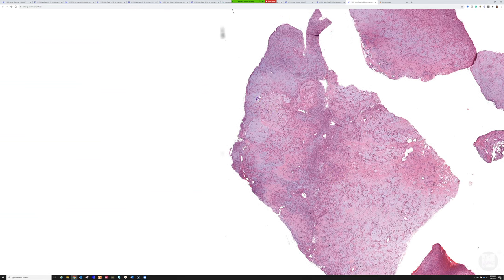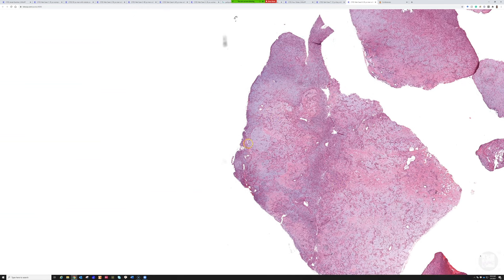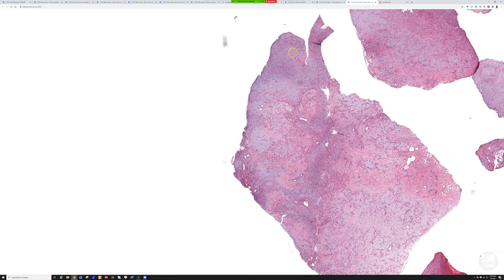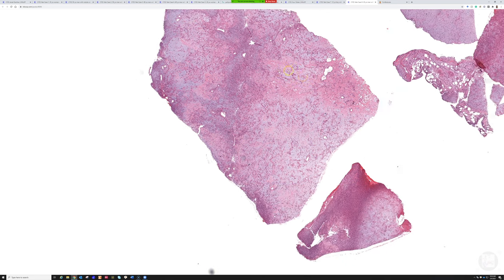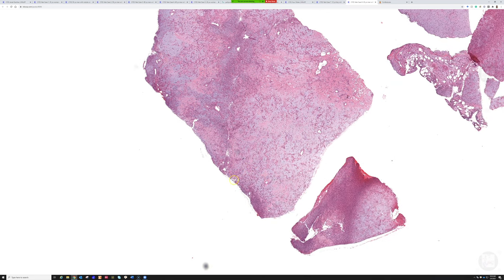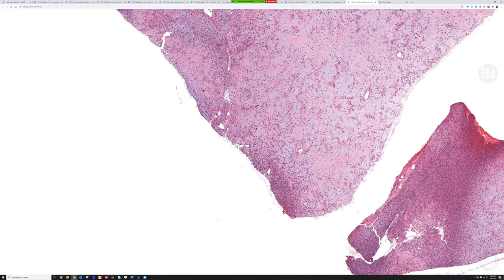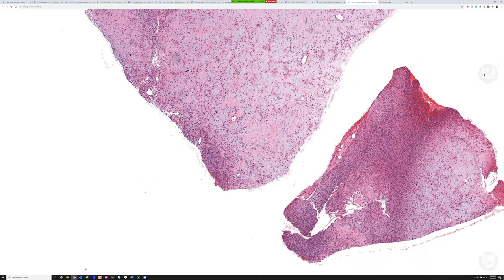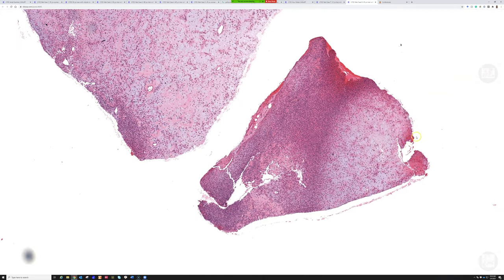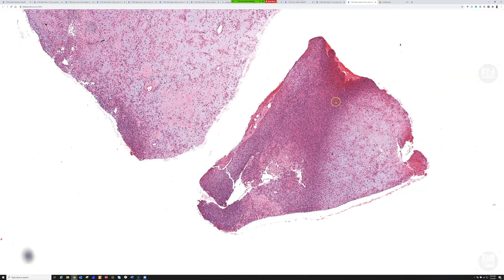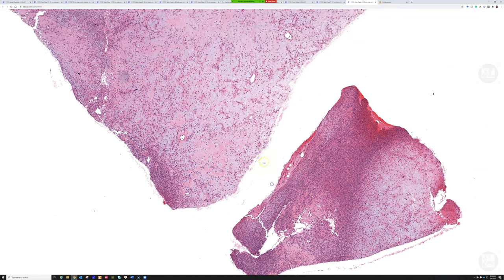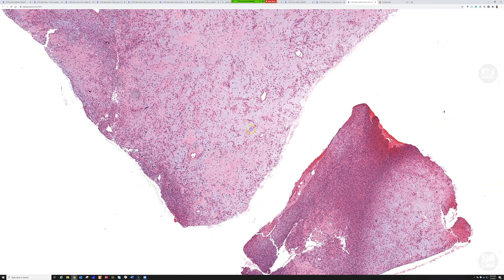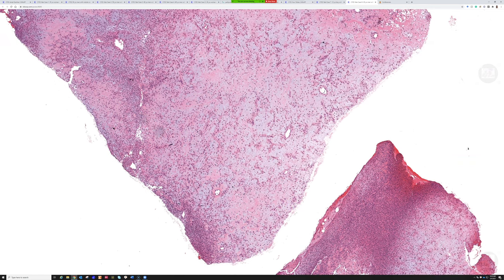When you get fragments, you have to think outside the box because it's hard with curette fragments. Again, hypocellular and then a band of cellularity. Hypocellular here, hypercellular over at the edge. Same thing on this piece: low cellularity, higher cellularity. I find that finding, plus the cytologic features, to be very helpful.